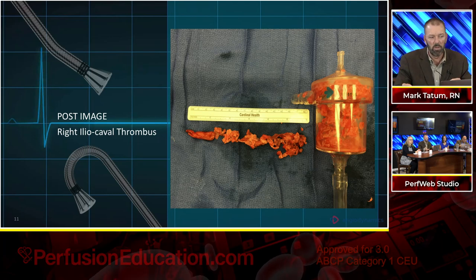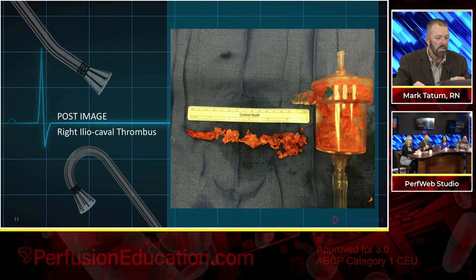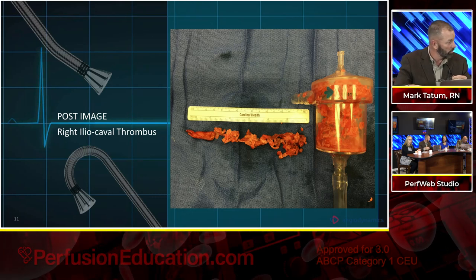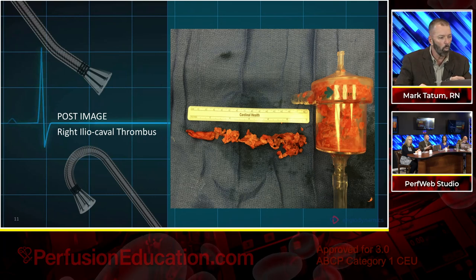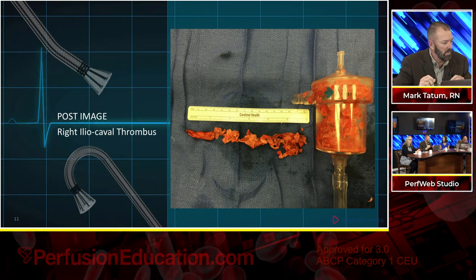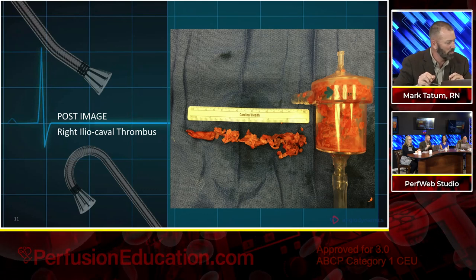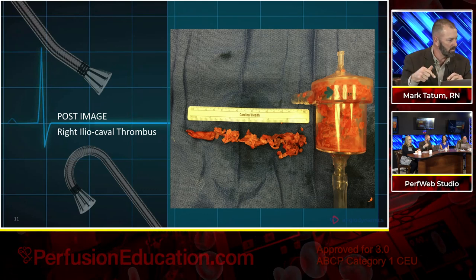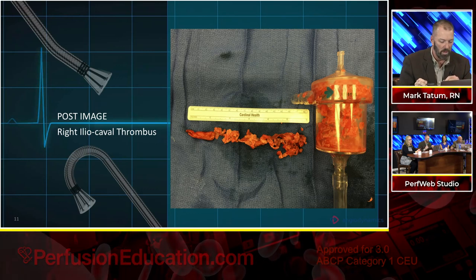Fortunately, many of the cases that we've done to date have shown this, and we've gotten a great result out of these. We got not only the fresh thrombus, but also some of the material comes in that has a much more chronic presentation. One of the options that I believe you had in your poll was should you use lytic therapy, and we may have talked about that for just a second. We'll go back to this during the discussion and talk about lytics in this presentation and what we think may have happened.